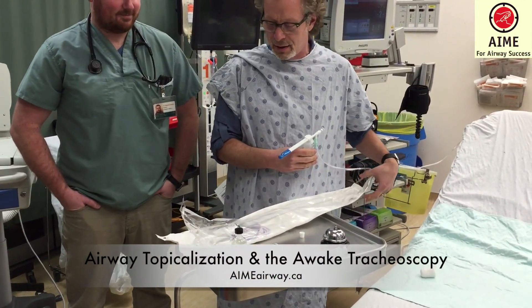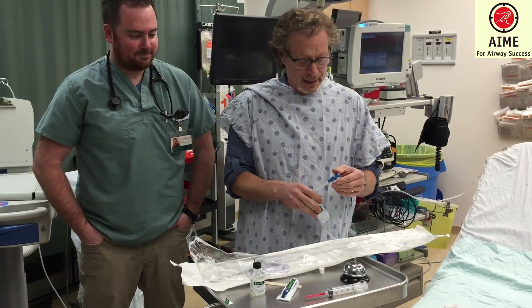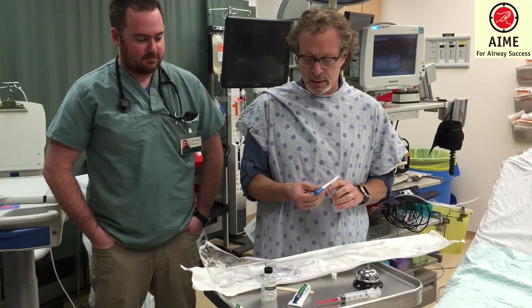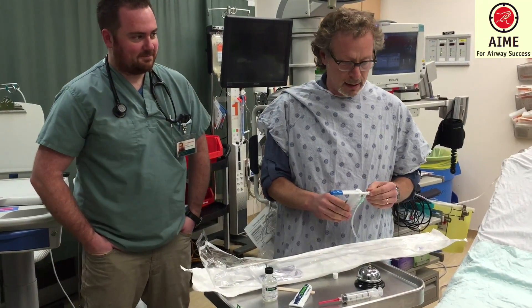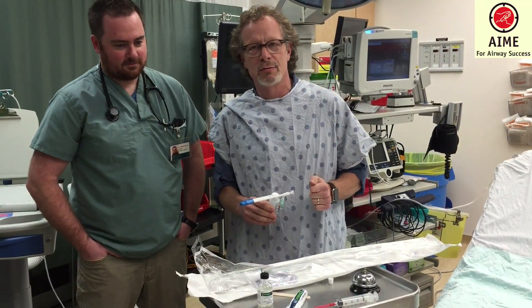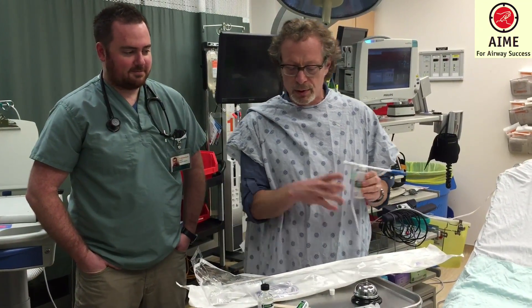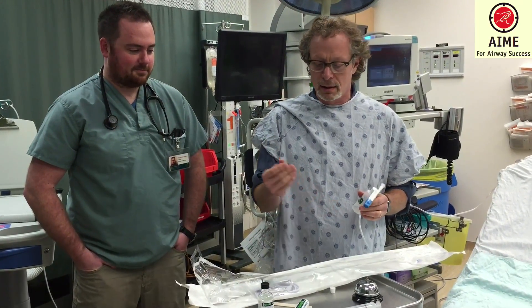George Kovach here in Mix Hours. We're in our resuscitation room for a reason. There's been a couple of tweets and some increasing interest in how we perform the awake intubation and have the patient tolerate it. What I'm going to attempt to do is an awake flexible — not just to look at the area, but actually to get down into my trachea and down to the carina. Whether it's going to be successful or not, I don't know. But the principles will be the same whether you're doing it with direct laryngoscopy or video laryngoscopy.